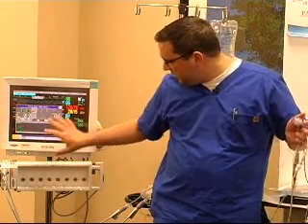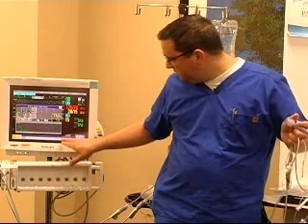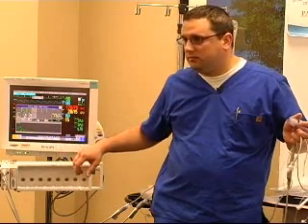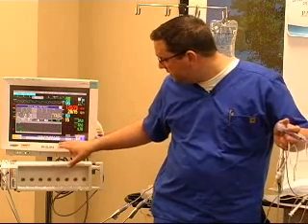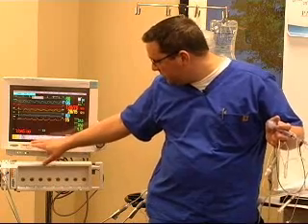So once you've done that, the way that you get this to where you can actually get it through the DAS system is you have to save your CO. Save CO, now it should be available in the DAS system. If not, you have to go back in here and look at it, but it is saved in the monitor at that point. All right, so then you're going to go to the next step, which is not usually on the second screen, but there it is.